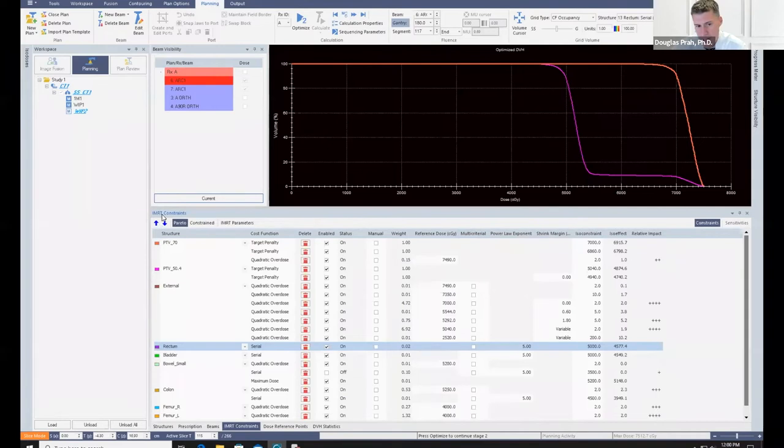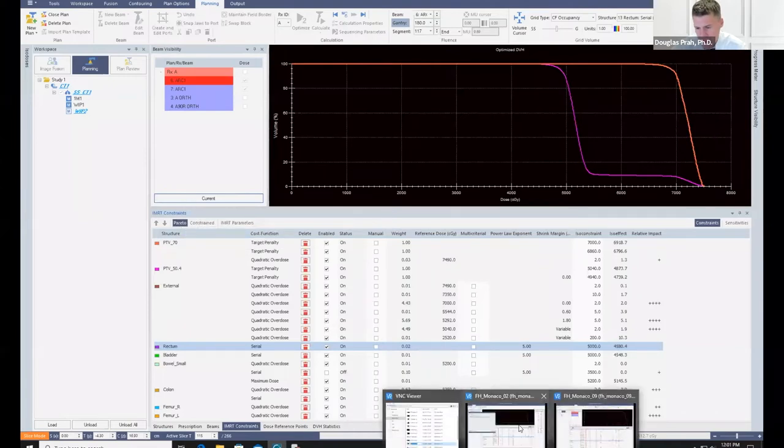So in principle, what it's doing is, when you're in Pareto, OAR, the maximum weight a function can be at is 10. So it caps that number. A more pragmatic way to put it is that it's just capping these numbers, so it can't keep pushing them so hard, and it's not going to keep looking for better and better solutions every time. But usually it's the more challenging cases that you're going to turn that off on, where you're not necessarily meeting the goals. So let's see how this is doing, and we'll go back to the other one.